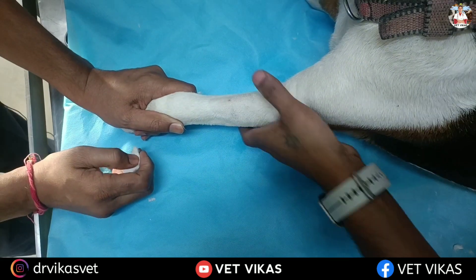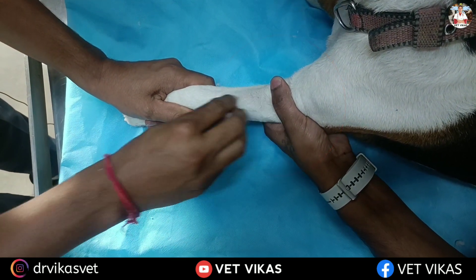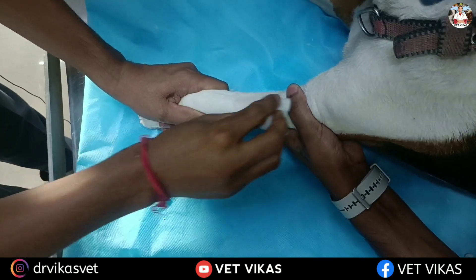Your assistant will raise the vein by putting pressure proximal to the site of IV cannula. Now slowly you have to raise the vein.